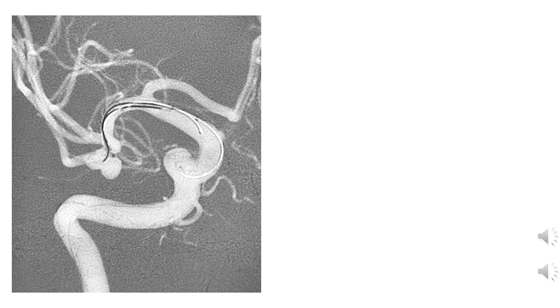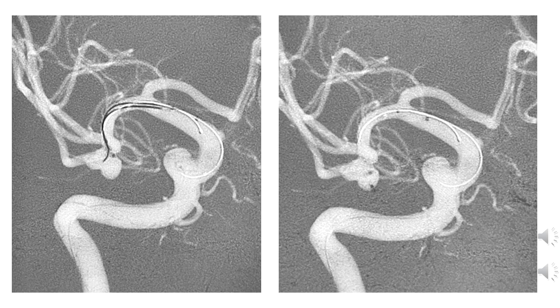However, this aneurysm was directed in a way that the microcatheter position was not stable, even though the micro wire was going into the other lobules. So we had to take both the microcatheters in one single part of the aneurysm. However, we were able to coil it properly, as we can see later. You can see that one of the markers of the microcatheter is near the fundus of the aneurysm, and the other microcatheter's tip is more proximal in the body of the aneurysm.